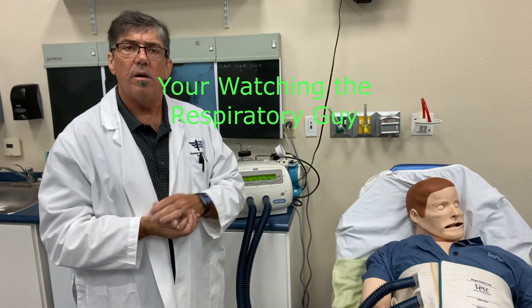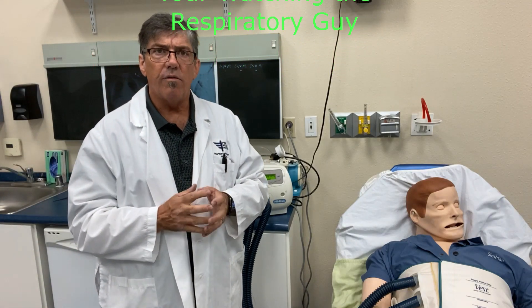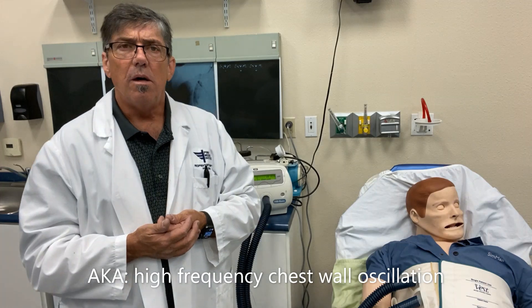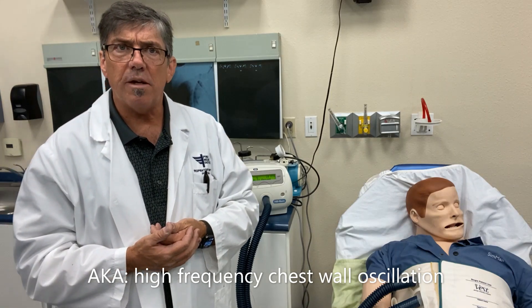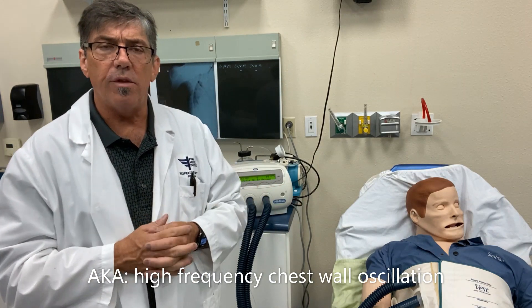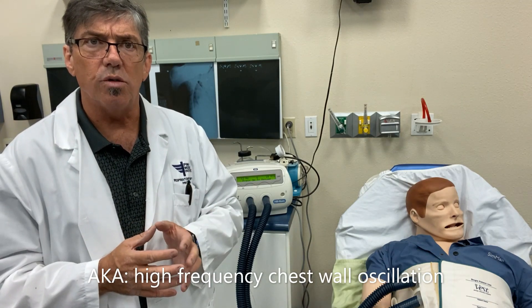Today we're going to be looking at our Vest by Hilrom — a really great device for vibration, vibratory percussion, and chest physiotherapy used very commonly in patients with cystic fibrosis. It makes the job of chest physiotherapy a lot more effective. This can be done at home as well. We'll take a look at the overview on how this therapy looks and then dive in and do some close-ups on the controls and on the setup.